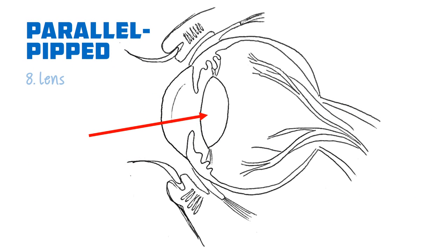Next, we need to examine the lens. We simply do this by moving the lamp forward — the iris and the cornea should now be out of focus and the lens should be clear. The most obvious thing to look out for is any lens opacity, so cataract, and that's pretty much the anterior segment complete.